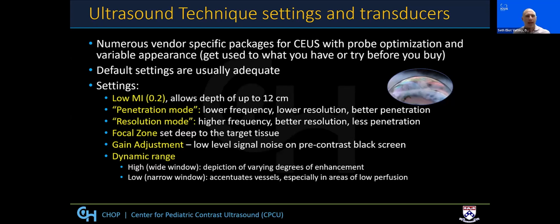Numerous vendor-specific packages for contrast-enhanced ultrasound are available. Not all pre-existing probes are contrast-enhanced ultrasound compatible, so it is important to be aware of probe compatibility and look at your currently available probes in interventional radiology when integrating it into your practice. You may actually have to borrow ultrasound units from your ultrasound department if needed.